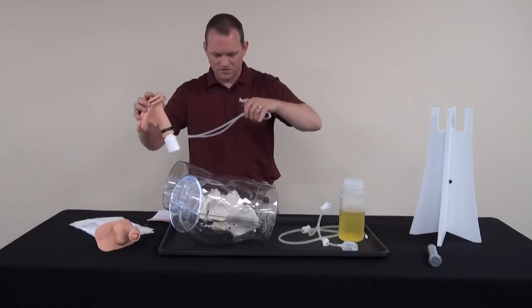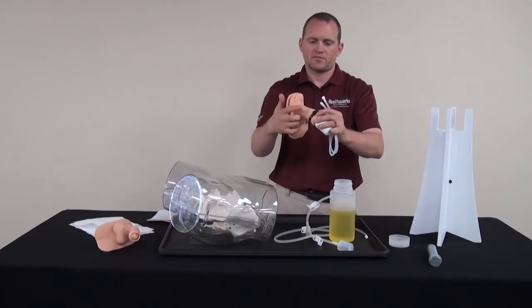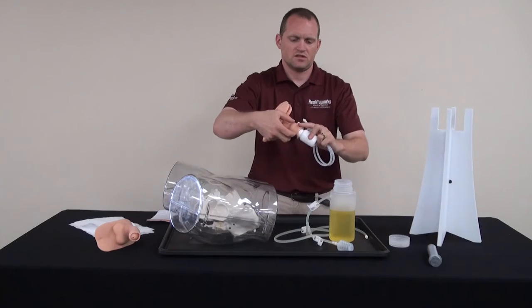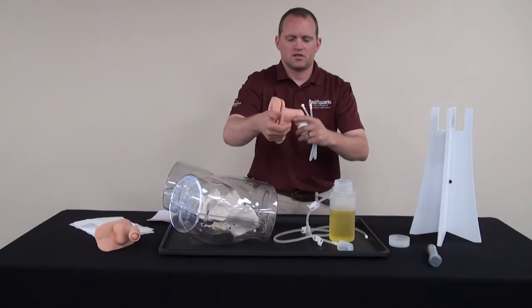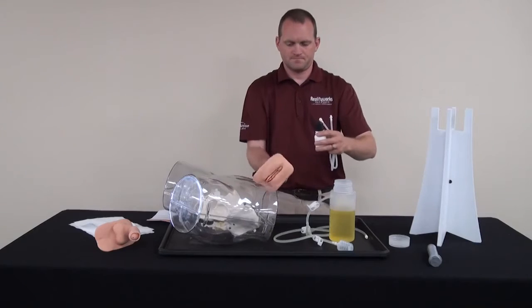from the transparent catheterization simulator by taking this black clamp here, sliding it off, and then pull the flange off of the bladder.